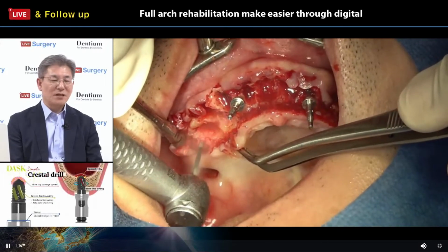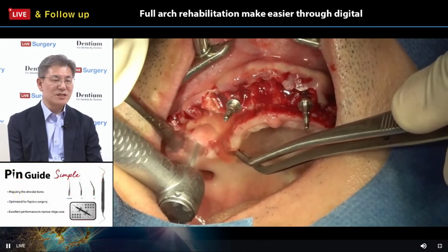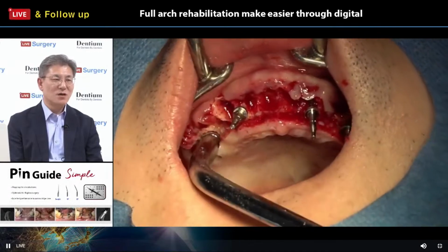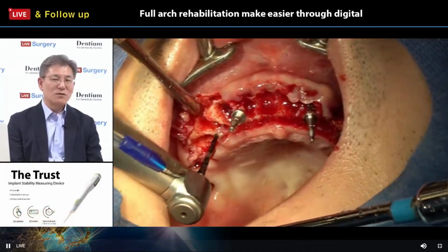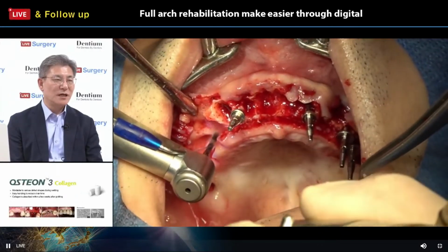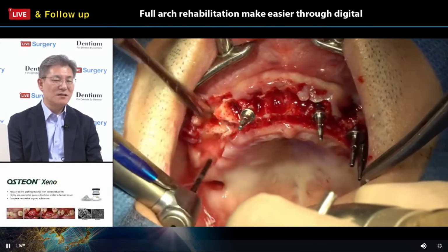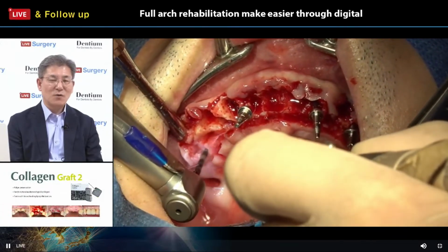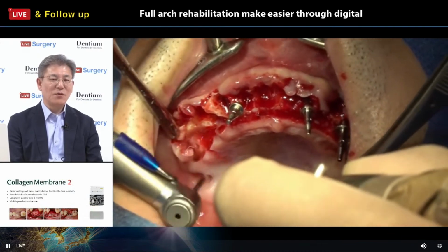Even if we do the bone grafting procedure, it is an auxiliary procedure, not the main procedure. So we can feel free to do bone grafting after installation. However, if we place the implant exactly at the number 12 extraction socket area, what will be the risky point?